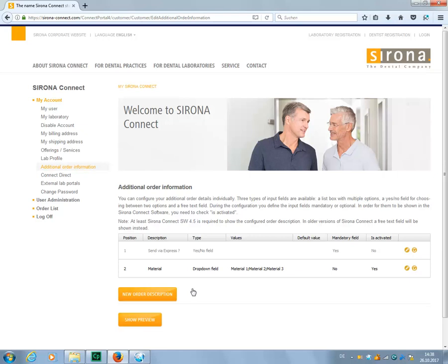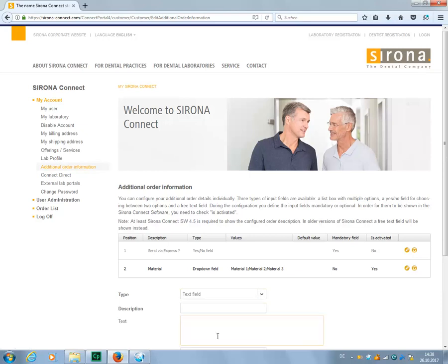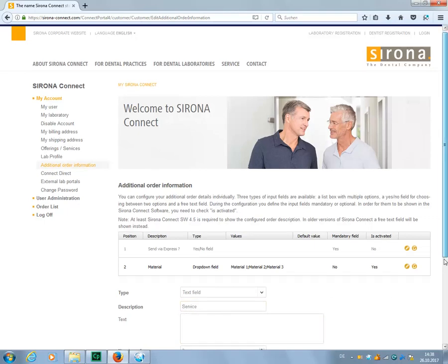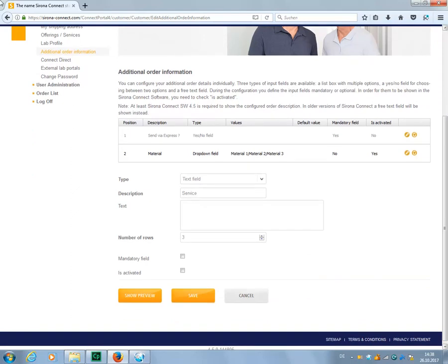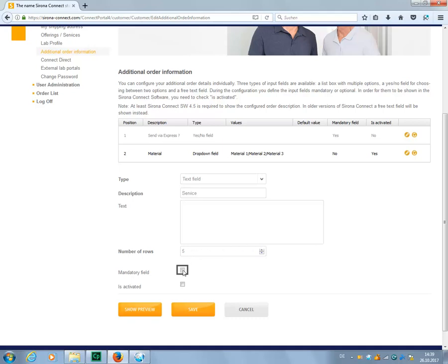In this case, let's enable the Is Activated checkbox and then save our entry. As type, we select Text field and, as an example, choose Service for the heading. We can also change the number of rows that are available to the dentist when entering the required information. We enable Mandatory Field and the Is Activated checkbox and save the third position.